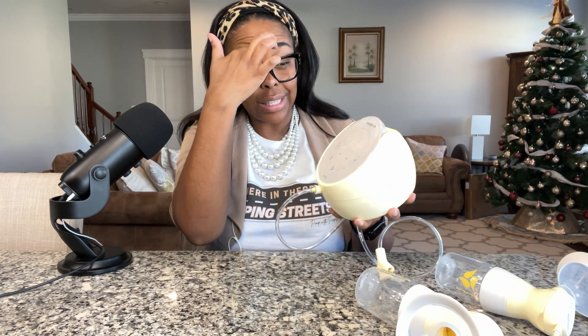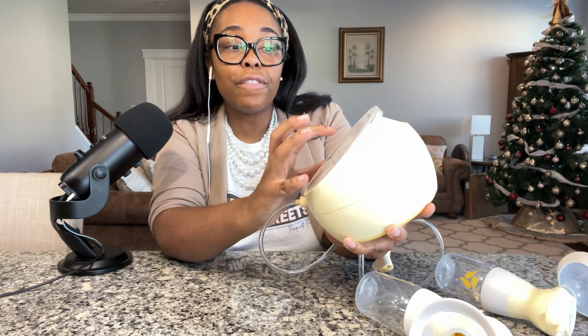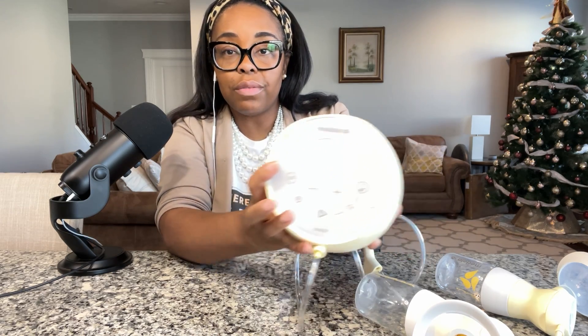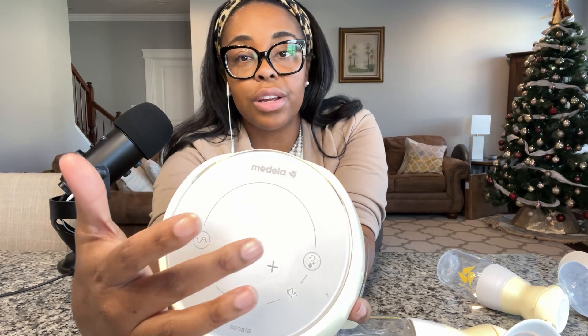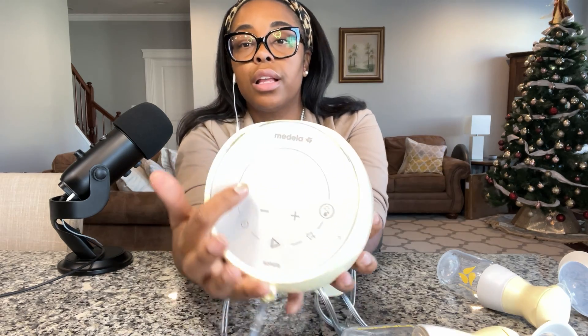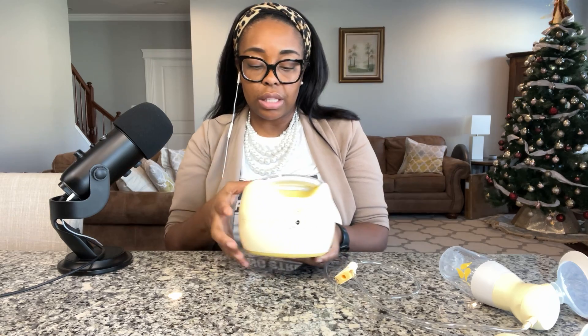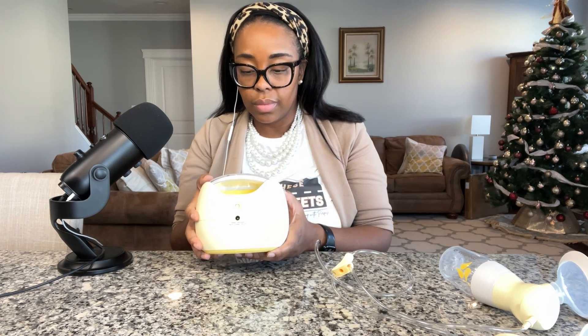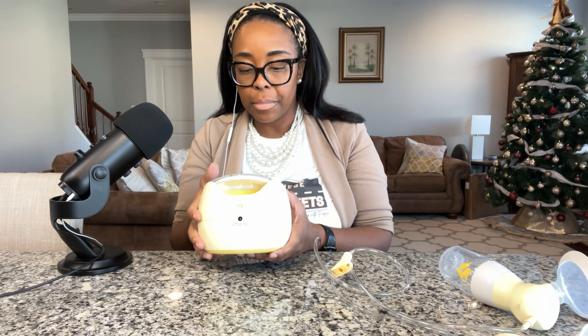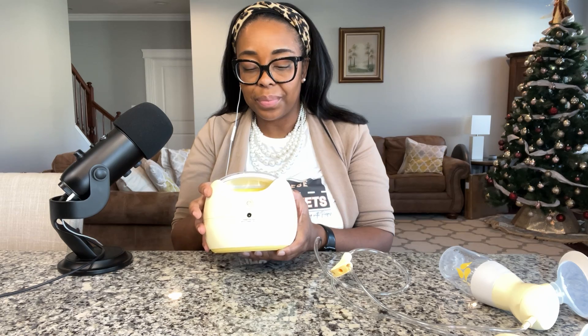I'm going to turn this on by pressing the play button. There we go — it's going. You can see the timer start and it begins on the first wavelength in let-down mode. I'll demonstrate levels 1 through 10 on the first wavelength so you can hear it. That's level 10. I'm turning it back down to one.